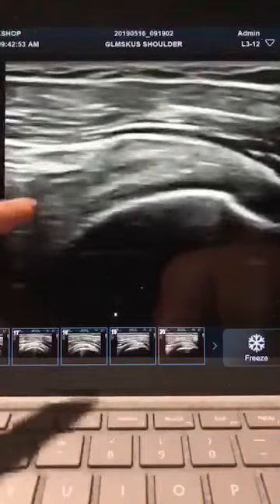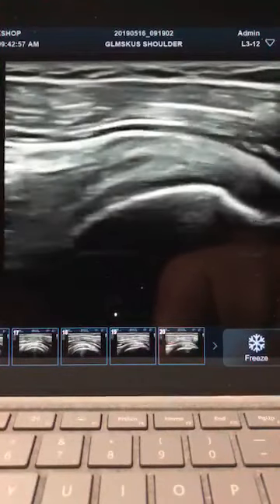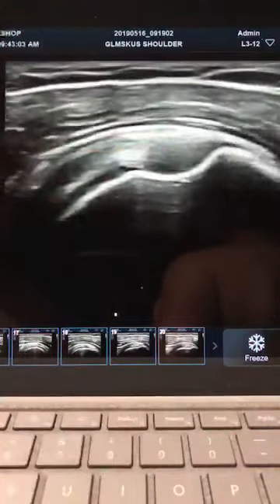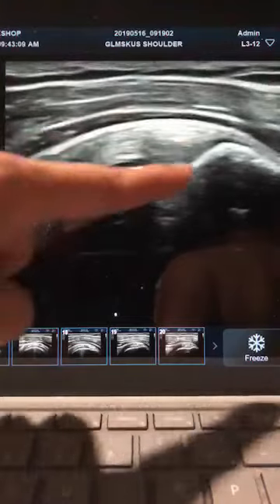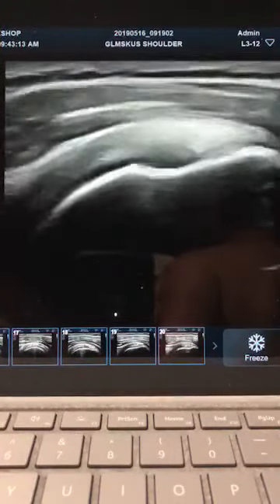So these could be areas where a non-displaced full thickness tear could hide, or partial thickness tears could hide in there as well. So one of the things I do is identify the biceps, identify that first slice that you come into being the anterior segment of the supraspinatus, scan a little more, you're in the posterior segment of the supraspinatus, scan a little more lateral, and tilt.